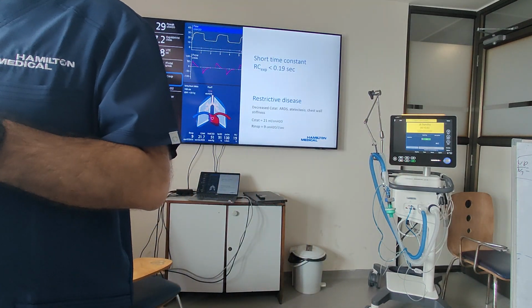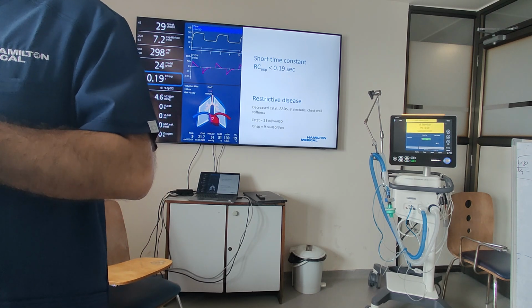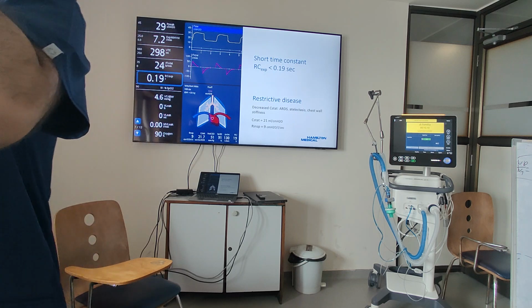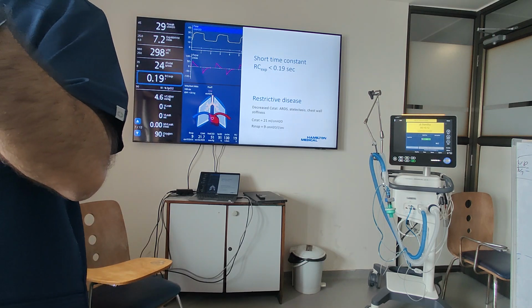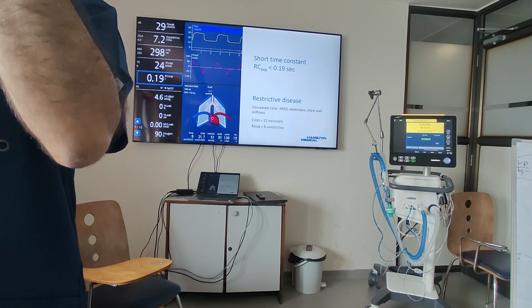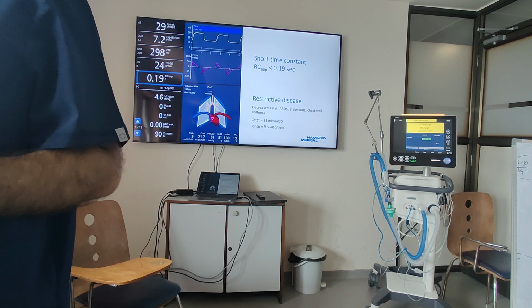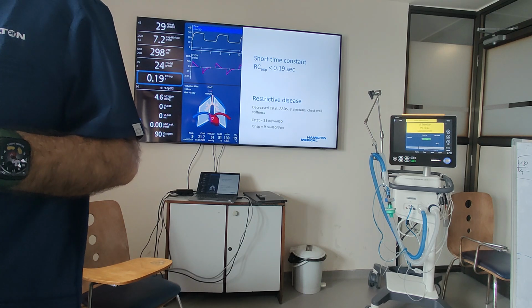So this VTE we were getting like thousands. So what is it, if it gives 1000? Actually, what happened, I'll tell you. Suppose you have an obstructive disease patient, now this can increase volume because the lungs will be hyperinflated, overly compliant. At that time it might give, but I have never seen it. Did it happen with anyone?